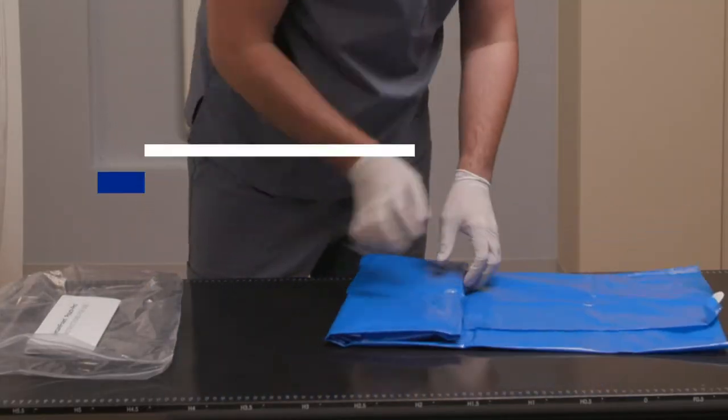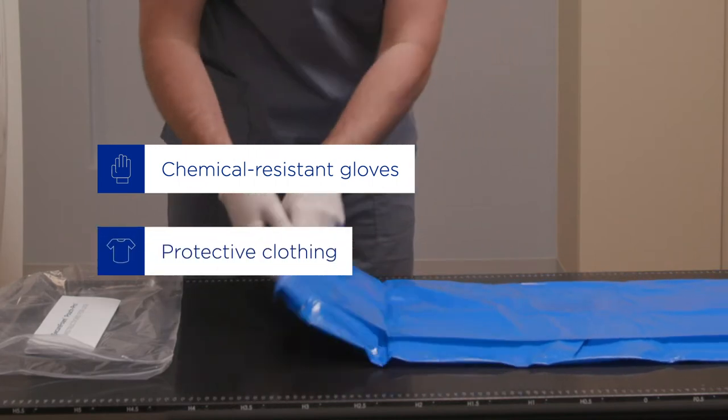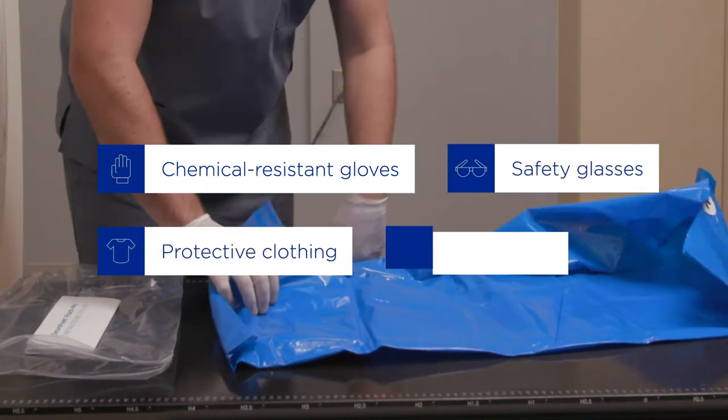Before you begin, make sure you're wearing chemical-resistant gloves, protective clothing, safety glasses, and a face shield.